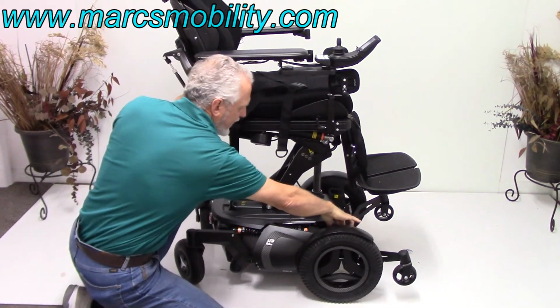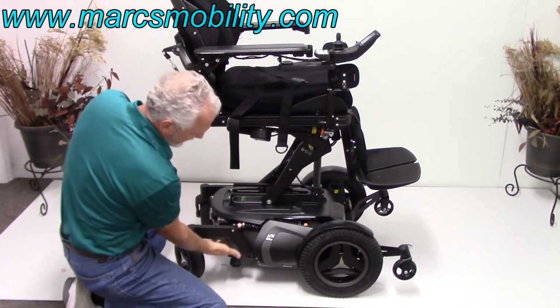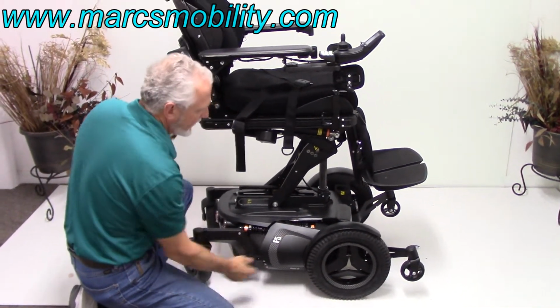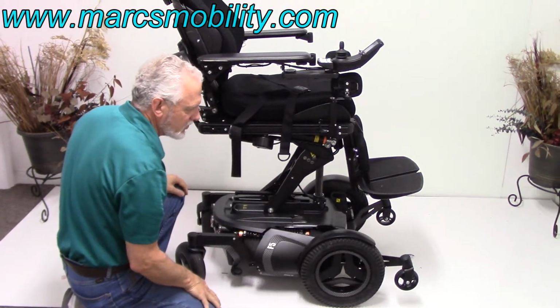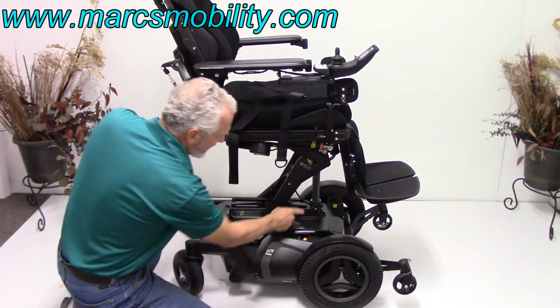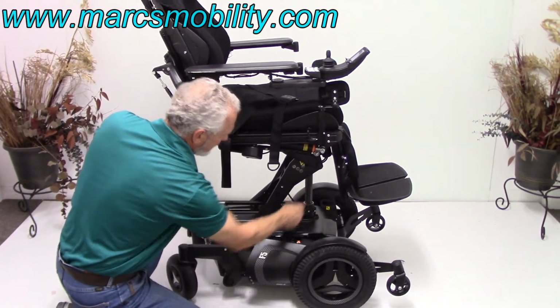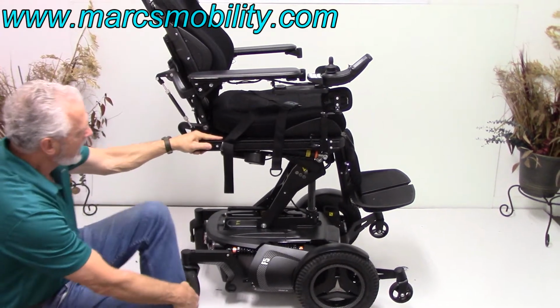You've got an anchor point here, and you've got another anchor point right below the shock, right behind this, right here, there's an anchor point. So if you need to tie your chair down to your lift or to your van, you've got 2 on each side, anchor points. This is your seat lift motor right here. It's at the bottom here. This is what goes up. That's your seat lift motor.